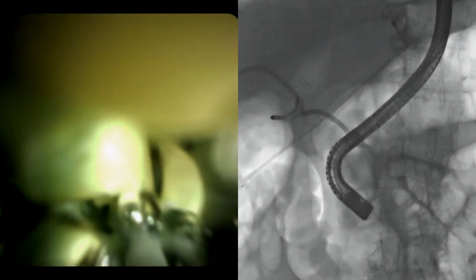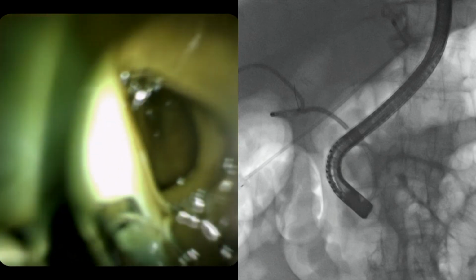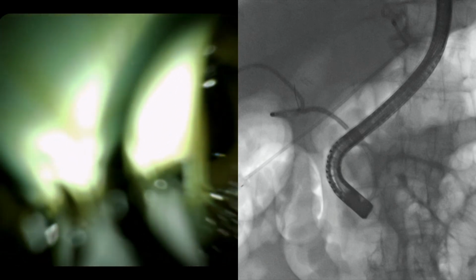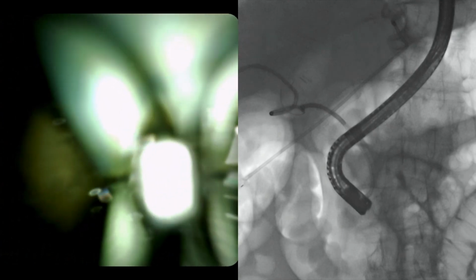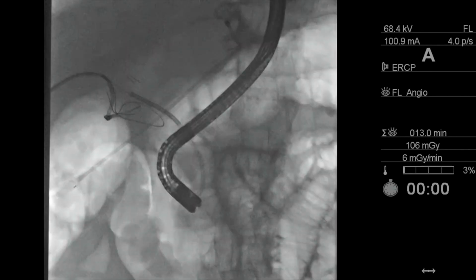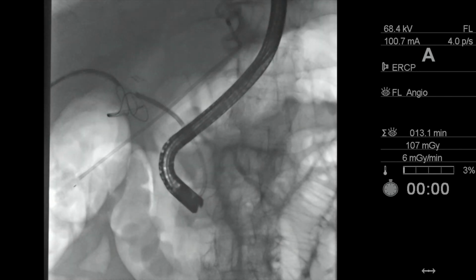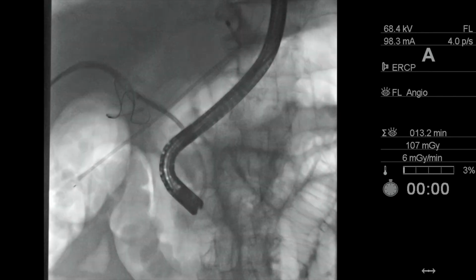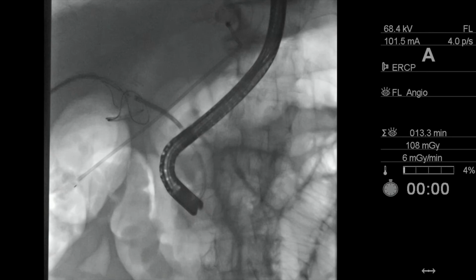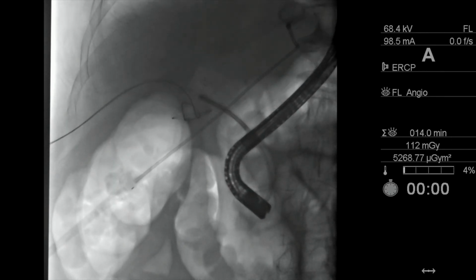With difficulty using an angled tipped guide wire, we were able to access a side hole of the percutaneous biliary drain. The guide wire was advanced, traversing the looped portion of the percutaneous drain and exiting distally into the subhepatic fluid collection. A safety wire was placed through the percutaneous drain and coiled in the subhepatic collection. The percutaneous drain was then removed, carrying with it the endoscopically placed guide wire. The endoscopically placed wire was then brought through the skin site to achieve maximal mechanical advantage for subsequent biliary interventions.